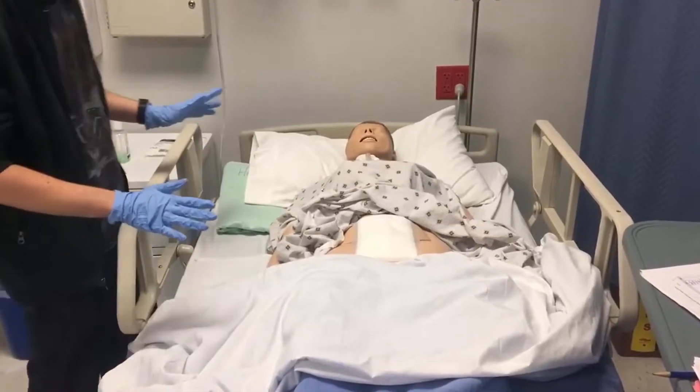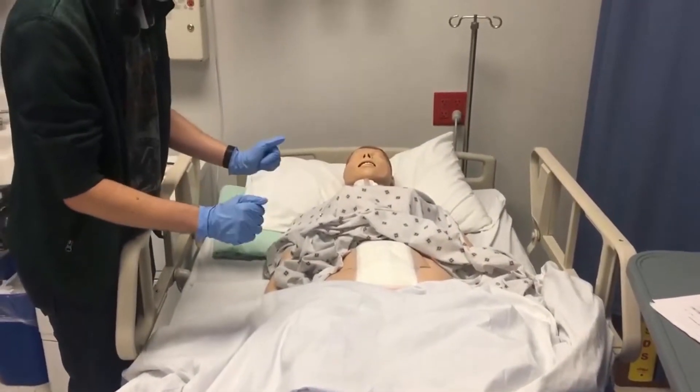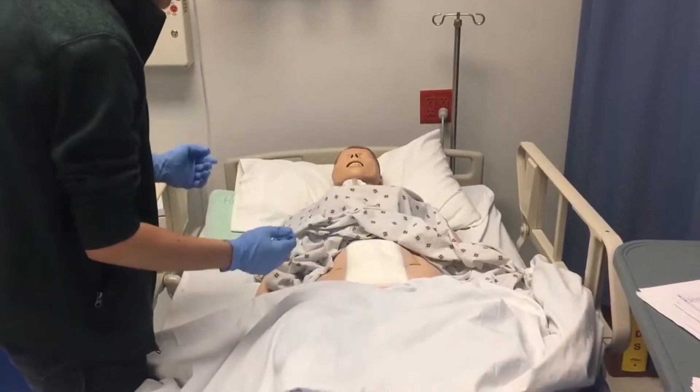So now I'm going to assess the dressing. I do not see any shadowing on the dressing itself — it looks like it's all clear. And I document that because the line is still blue.